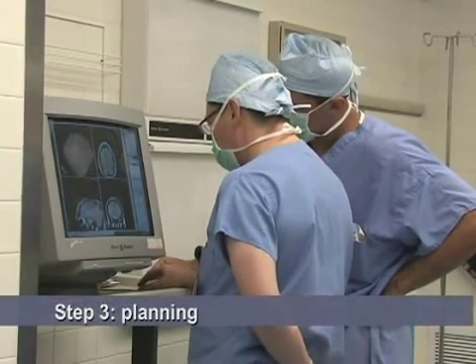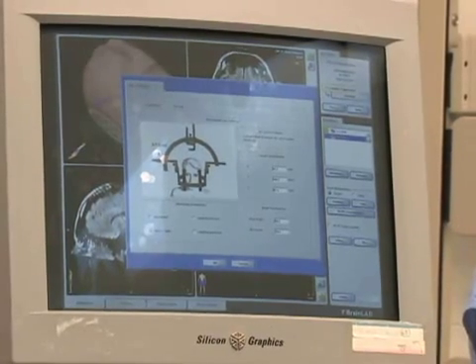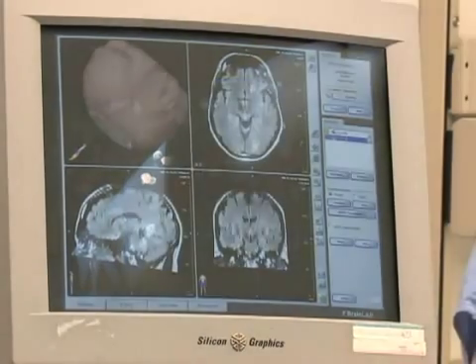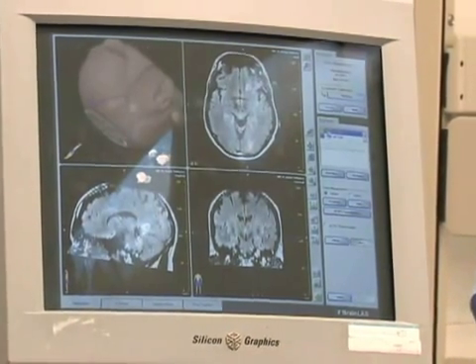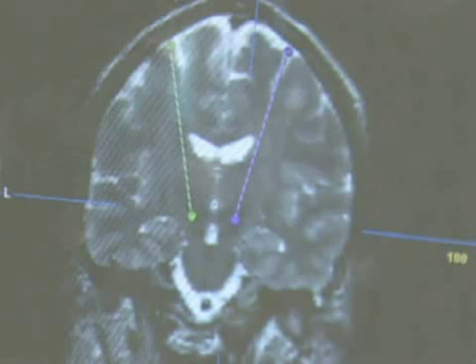A computer fuses the CT images with the MRI images taken earlier. The surgeon plans the exact trajectory of the electrodes, much like a pilot creates a pre-flight plan prior to flying. This critical step ensures that the electrode tip is placed precisely in the subthalamic nucleus.